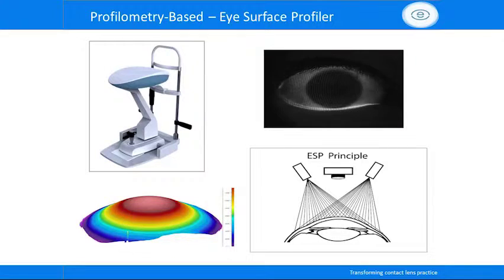You may have heard mention from Brian earlier that the instrument uses fluorescein, and this allows us to image not only the cornea, but because you have fluorescein over the surface of the sclera, you can image from there. The great advantage of this is that you can then gain direct measurement of height from the whole of the cornea and out into the sclera. Now, when I say direct measurement, that means there's no extrapolation or interpretation of the data.